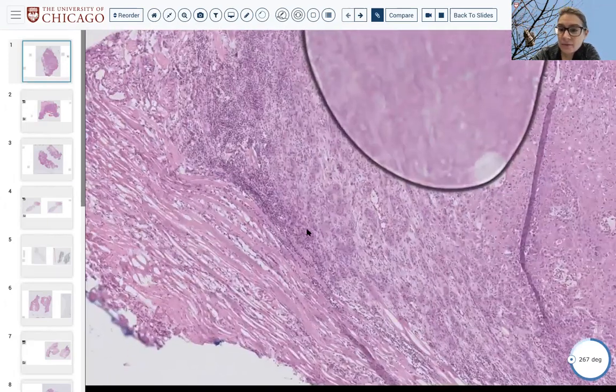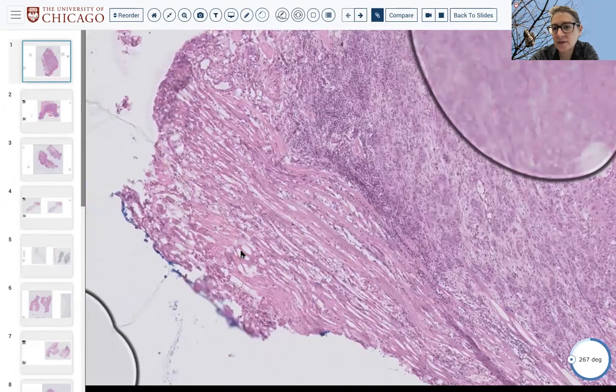even if it's negative, right? Technically, this is not cutting through tumor. This is a negative margin. But in this context, what do we know is important? Definitely 1, perhaps up to 3 or so millimeters. So in this case, you are going to want to give them an exact measurement. Like this is 1 millimeter from margin. This is essentially a positive margin.